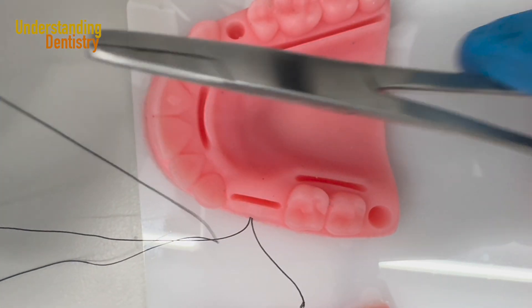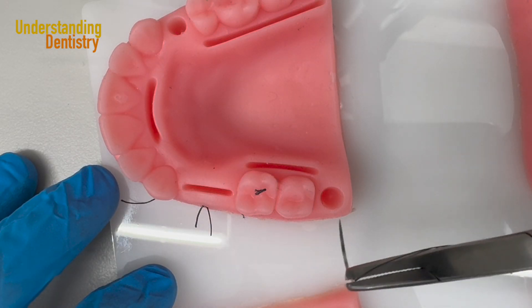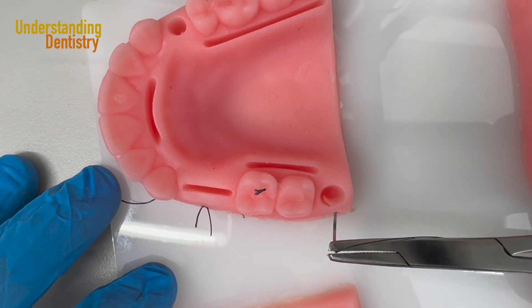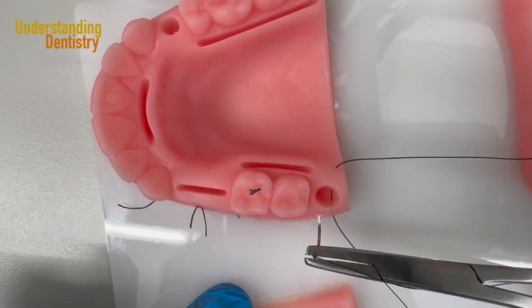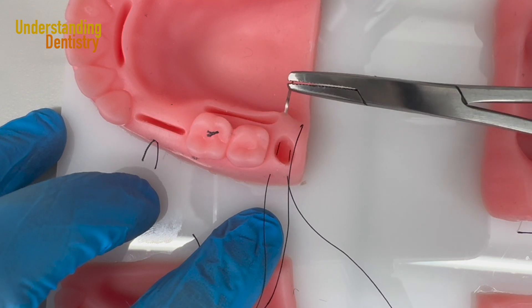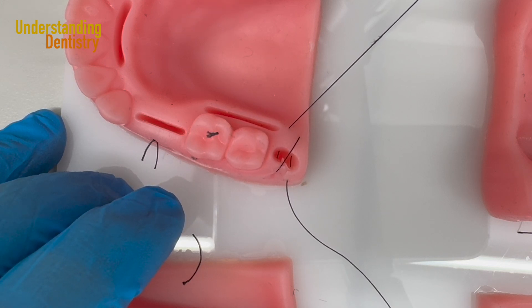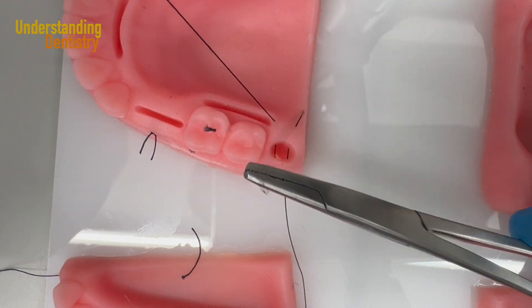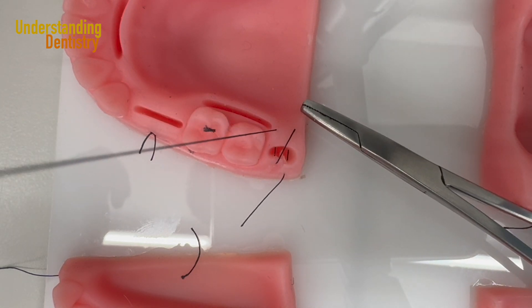Another very useful suture is the socket X suture. There are two ways of doing this — I'll go with the normal X type. Let's understand this is a socket of a molar and I want to suture the socket to keep the blood clot and prevent food from entering. We go buccal to lingual first — don't forget this is an X suture. Then buccal to lingual again on the mesial aspect of the socket. I came from distal buccal and I come out from mesial palatal. You can put your instrument in the middle to help pull the thread — pull one hand and pull your instrument — then finalize the suture with that extremity.